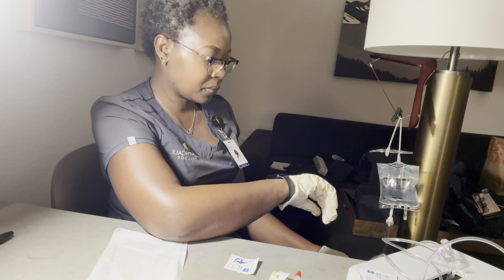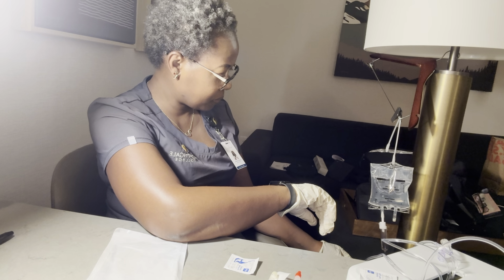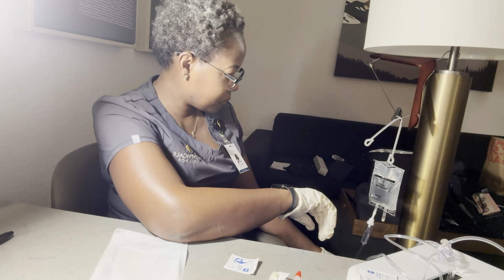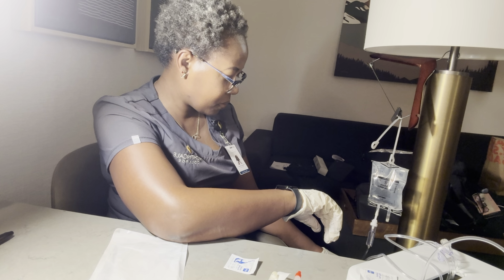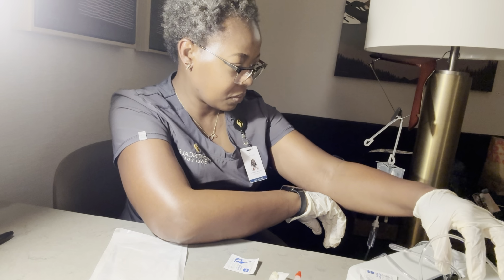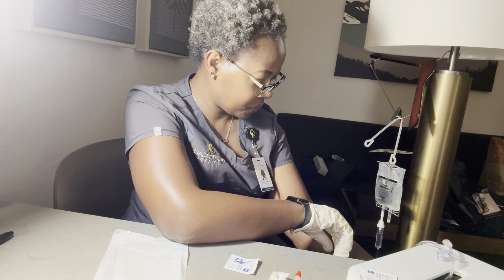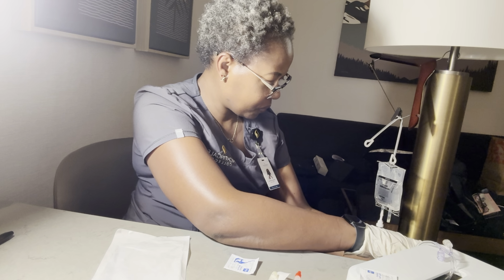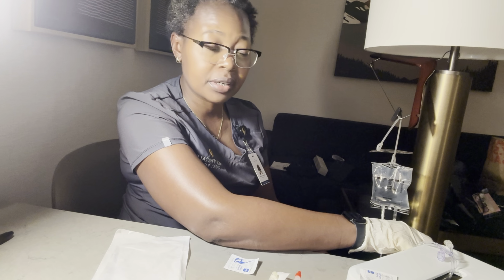So open the chamber. So I have that one taken care of, 38 drops per minute.